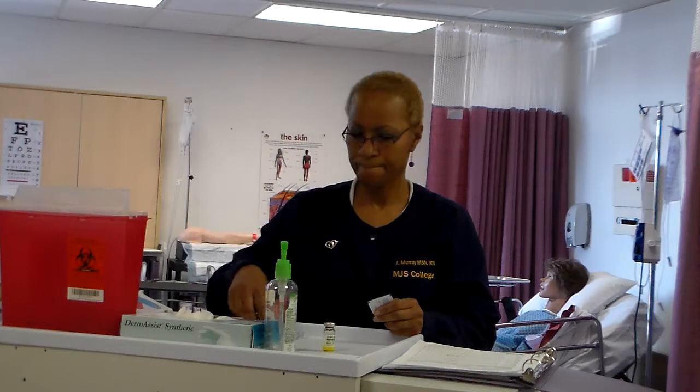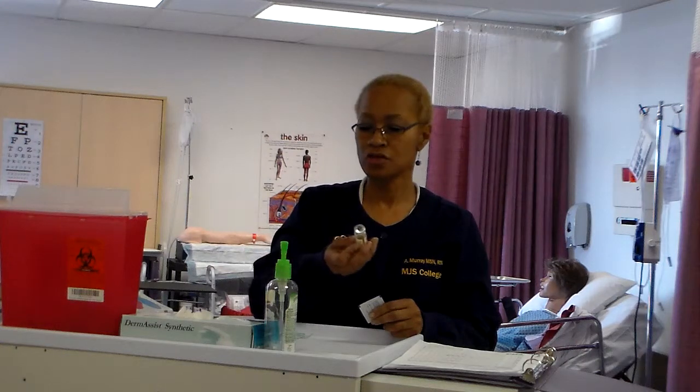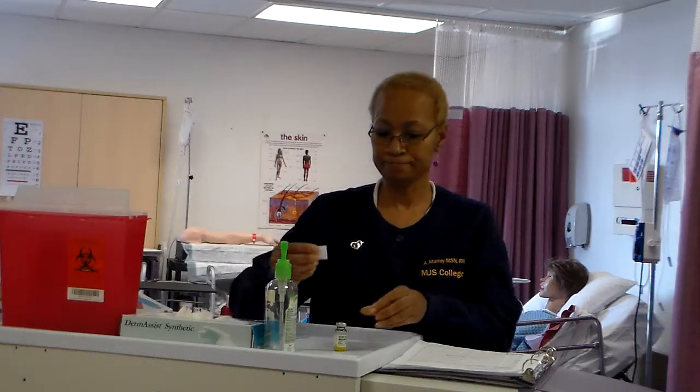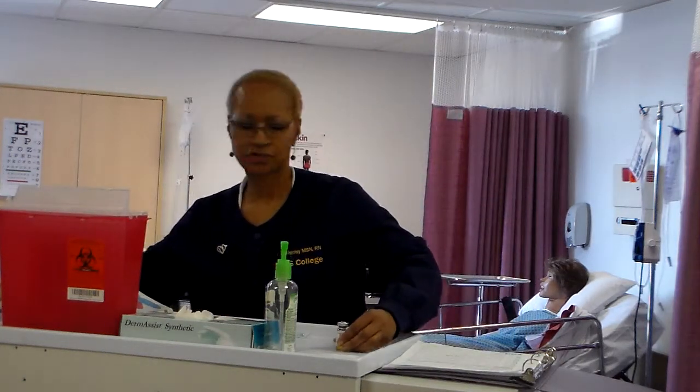If a multi-dose vial has been used before, cap is already removed. Okay, so this one is a multi-dose, and so the cap is already removed, the plastic cap. Go ahead. Firmly and briskly wipe surface of rubber seal with alcohol swab and allow it to dry. I don't know if you guys can see that, but this is actually some powder on the cap on the rubber stopper itself. So you want to make sure you do a good scrub, because not only are you removing any medication that may be there, but any organisms that may be on that rubber stopper. And then allow it to dry.